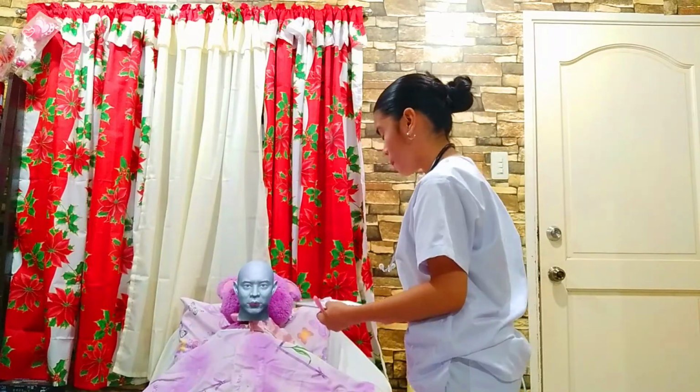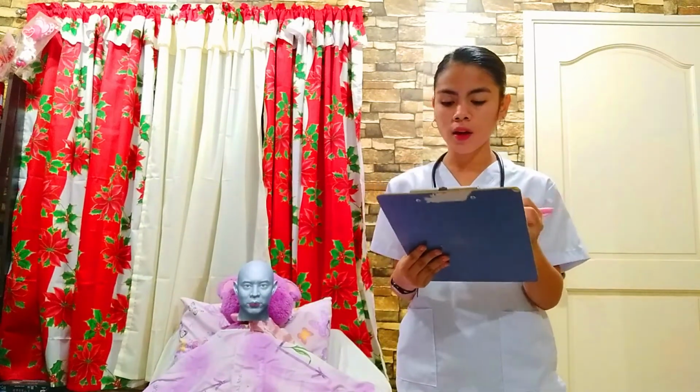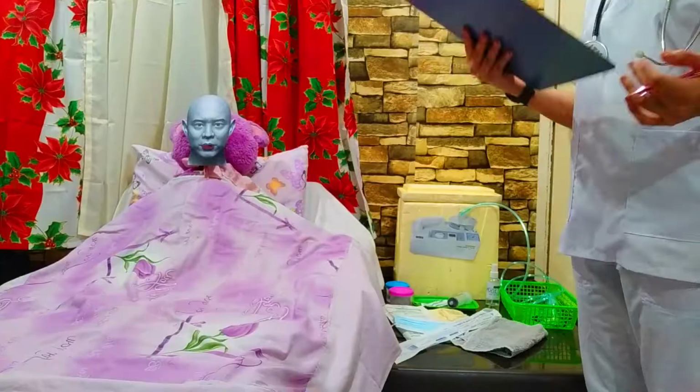Would that be okay with you po? Okay. So as you can see, I already did the confirming of the patient using the two identifiers, specifically his name and the birth date. And also I already did the explanation of the process to the client.